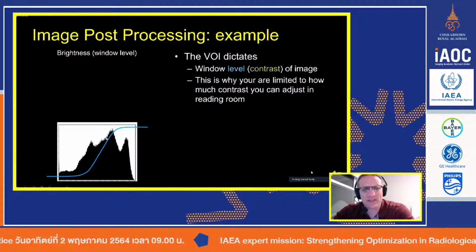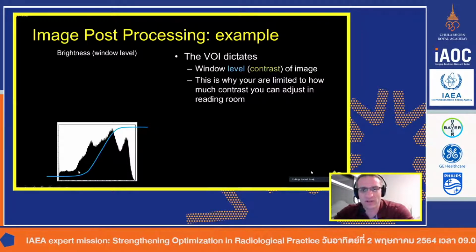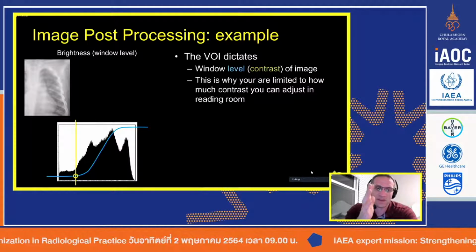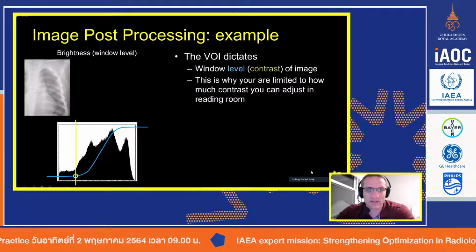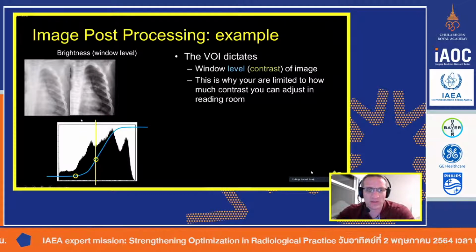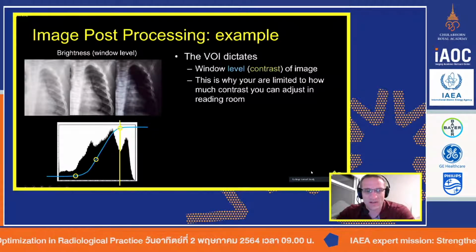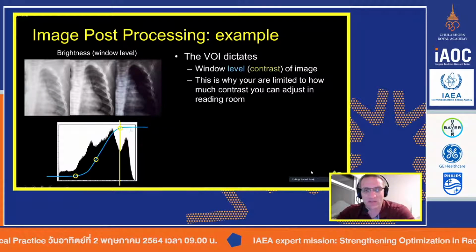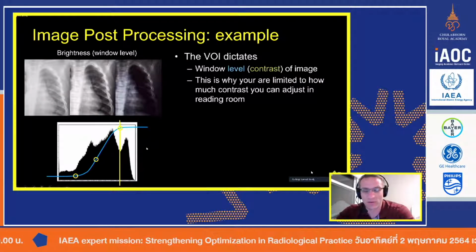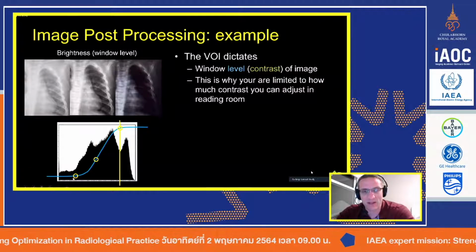All right, so these curves will set the level of contrast in the image. That's why we're talking about how much image contrast we can set. If we set the window level to a very low number, obviously you get less contrast. If you set your window level to a medium level, you get a nice, probably good contrast. And if you set the level too high, it's focusing the reconstruction on the higher end of that scale, which basically shifts everything more towards the blacks. So setting your proper window level when you reconstruct is very important because it will change how the image looks based simply on that level value you set.